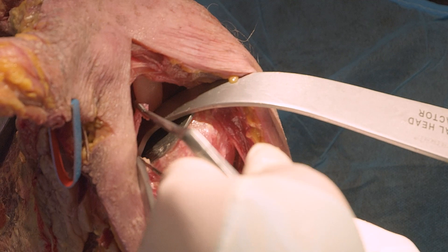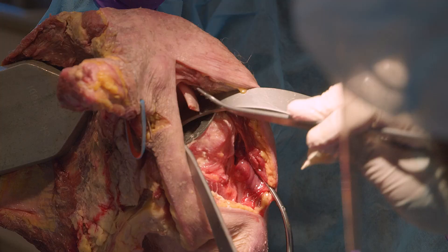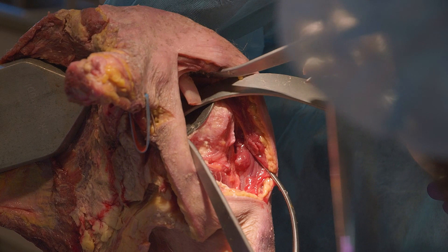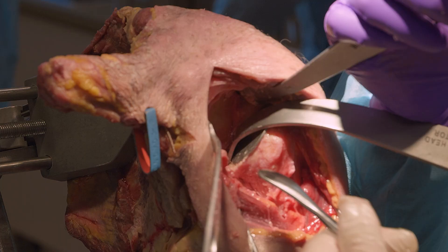This will also show scraping of the glenoid. I highly recommend removing any remaining glenoid cartilage before GPS — this system is accurate to less than one millimeter, so even taking off a slight amount of cartilage is extremely helpful. You can see where I added the posterior superior retractors, which helps visualization during biceps resection or any glenoid exposure.